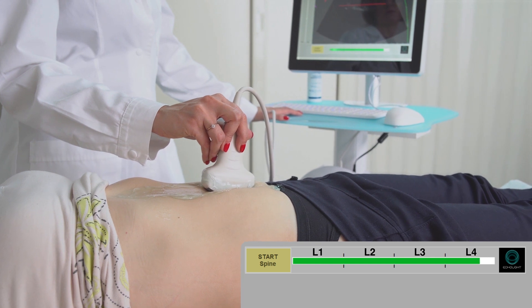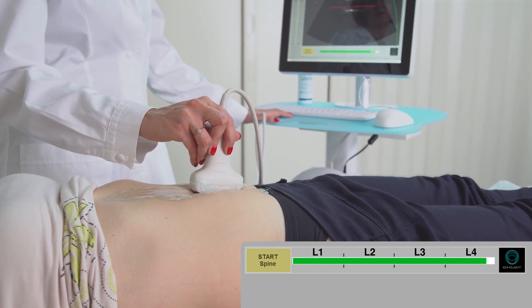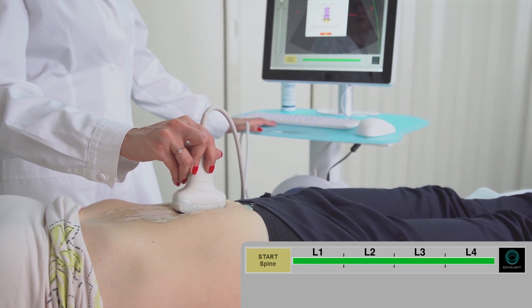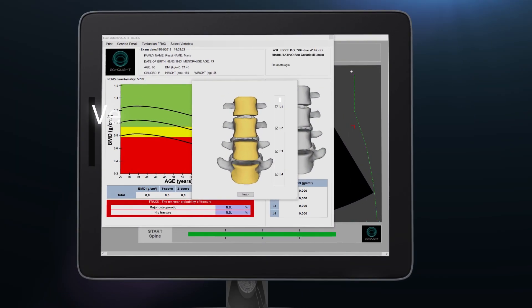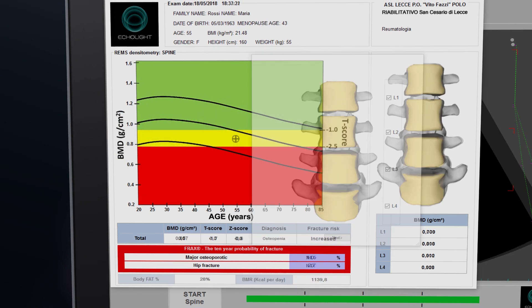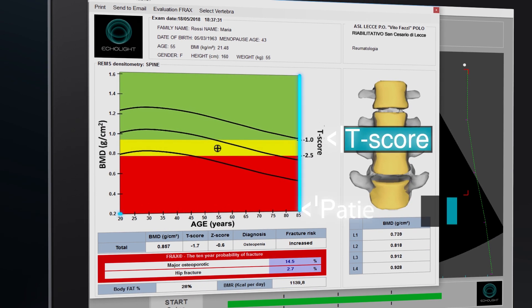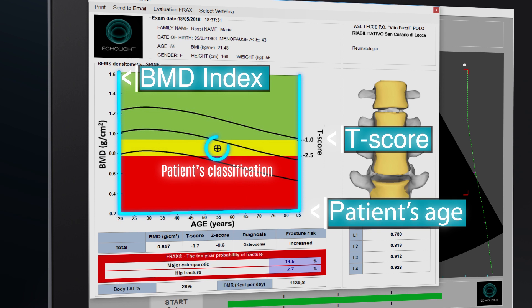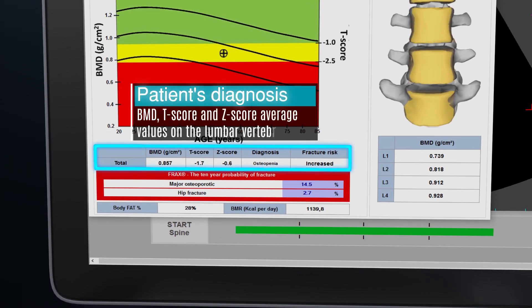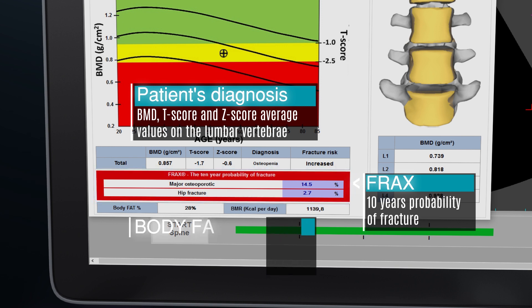Data analysis is totally automatic. After a few seconds, the medical report will be displayed on the screen. The operator can include or remove every single vertebra by selecting the relevant box. In the medical report, a mark displays the patient's position on the graph and their BMD and T-score values according to their age. The average BMD, T-score and Z-score values and the relevant diagnosis are displayed on a chart.